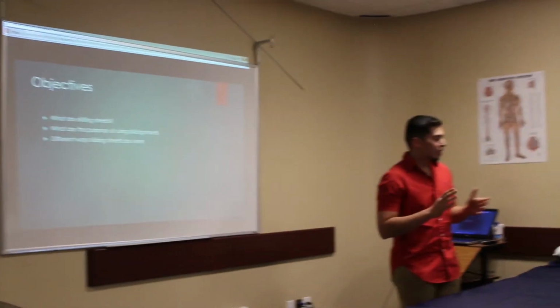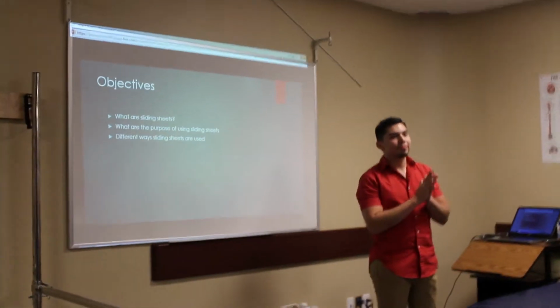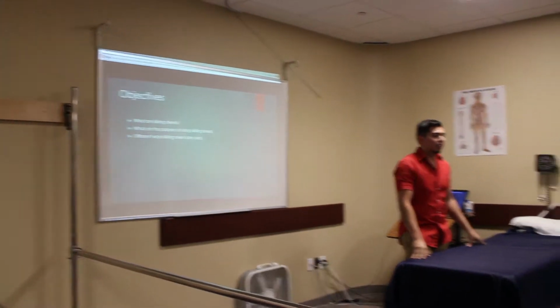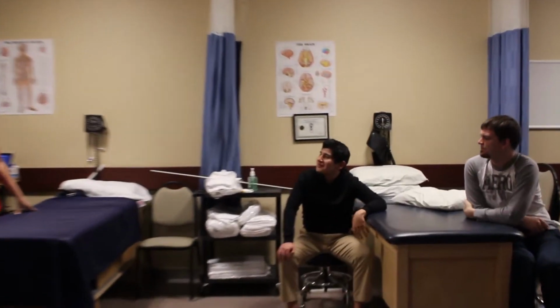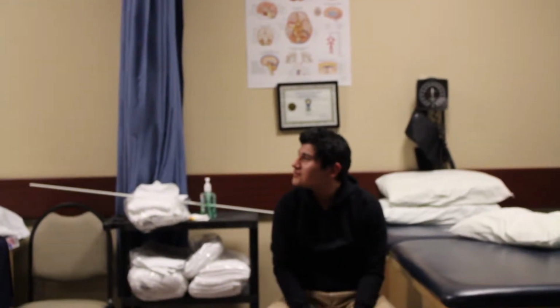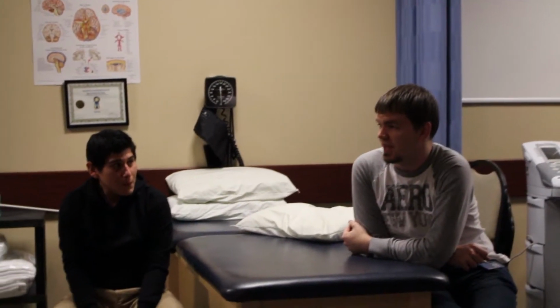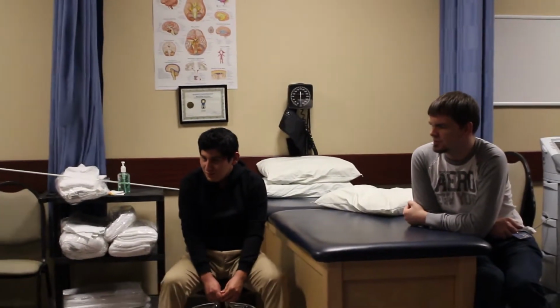And let's ask you some questions. What are the benefits of using the slide sheet? Safety. What kind of safety? Like for your back, as a healthcare professional, so you're not straining. I've had experience using them that work a lot better than trying to lift a 300-pound person. Yep.